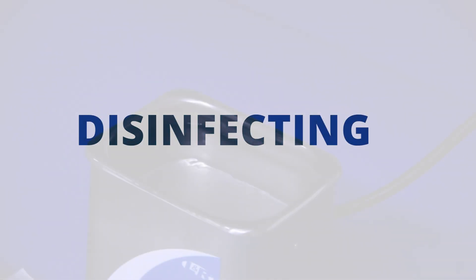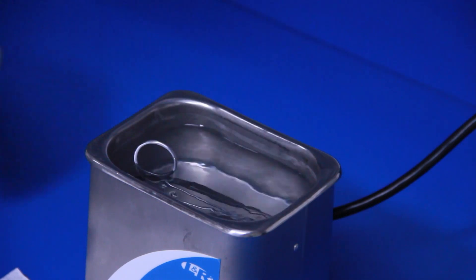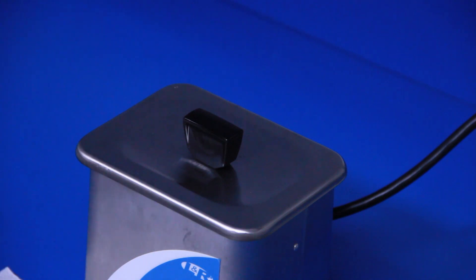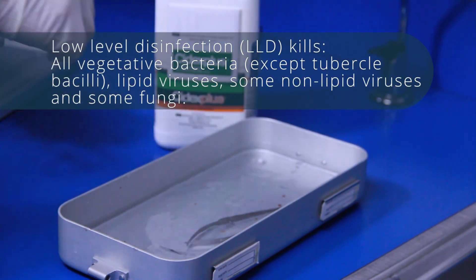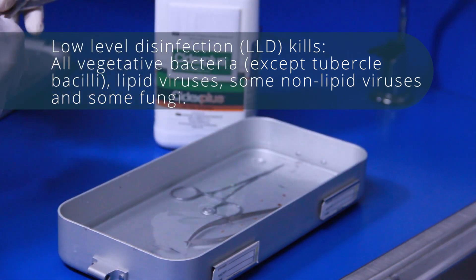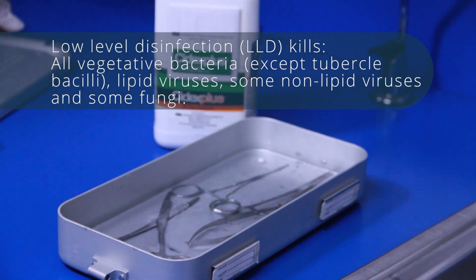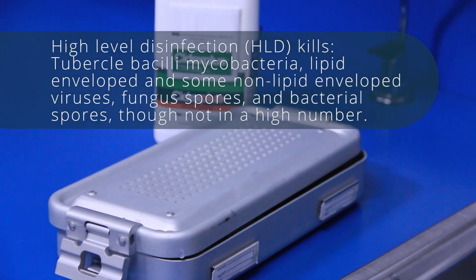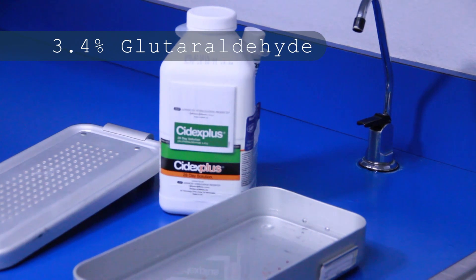Disinfection and sterilization are essential for ensuring that medical and surgical instruments do not transmit pathogenic microorganisms to your subjects. There are several levels of disinfection. A low-level disinfection can be accomplished in about 10 minutes and it eliminates many microorganisms. At the other end of the spectrum, a high-level disinfection destroys even more microorganisms. Cidexplus can be used as a high-level disinfectant.